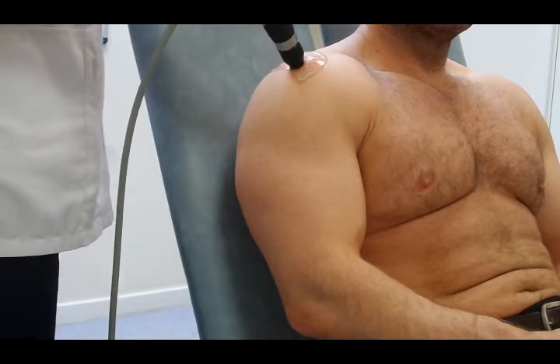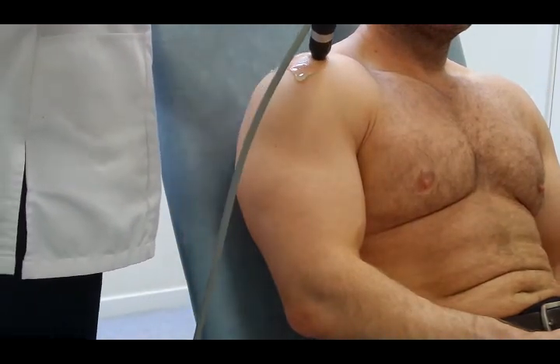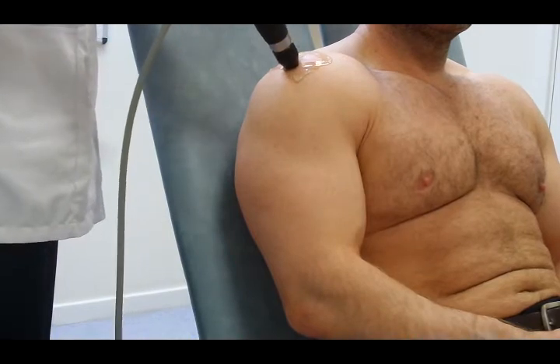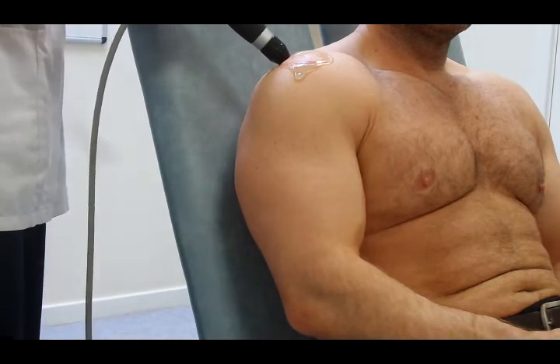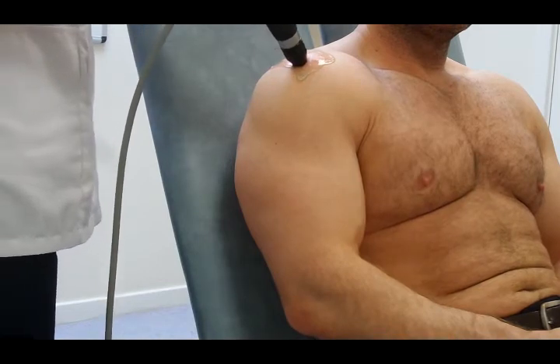There may be painful areas that you might want to concentrate on. In this case there's a painful area at the back and a focal painful area at the front. Some people would call those trigger point areas — they're probably just the most tender part of the supraspinatus tendon in the condition as it is at the moment.